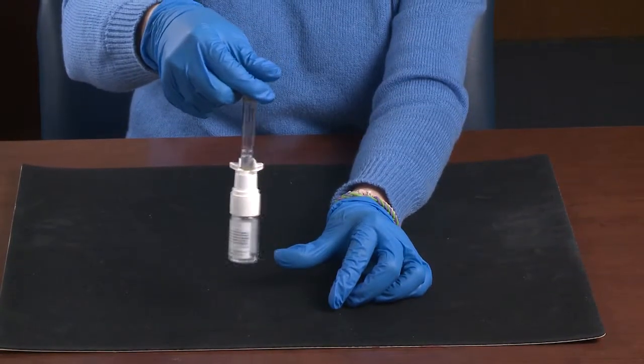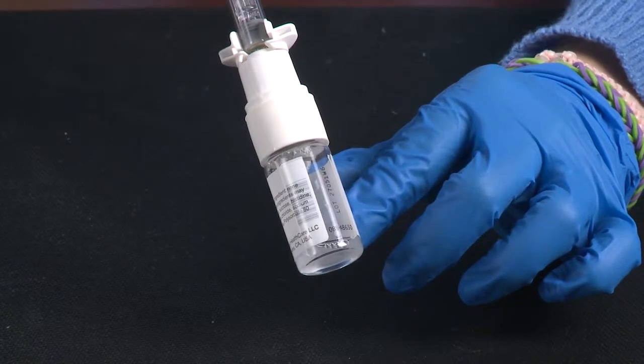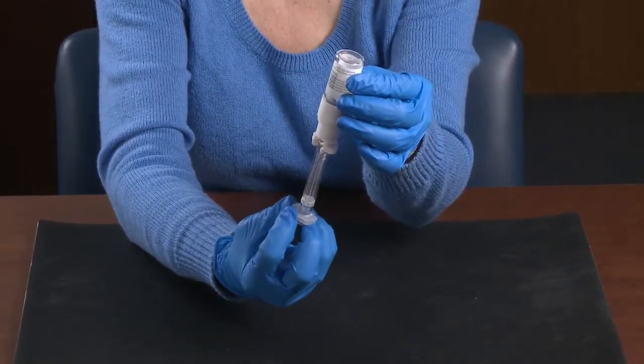Mix completely by slowly swirling the factor. Inspect to make sure that there are no particles and the factor should be clear. With the syringe and plunger rod attached, turn the system upside down and withdraw all of the factor.